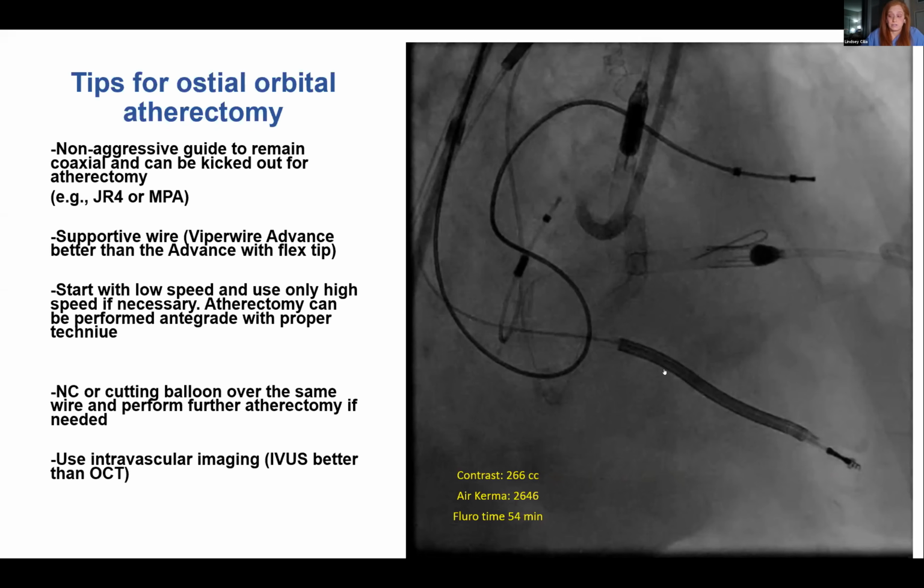So I actually have never, I've had a couple of perforations and we have never used a ping pong technique, although that is a great idea to use. We will immediately provide balloon tamponade proximal to the site of the perforation, try to advance our guide liner as far down as we possibly can, get the Papyrus ready, and then just quickly do the exchange and deliver the covered stent. I haven't used the ping pong technique yet to deliver the covered stent.